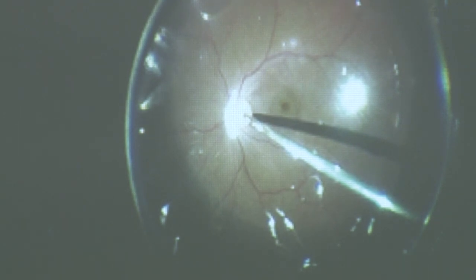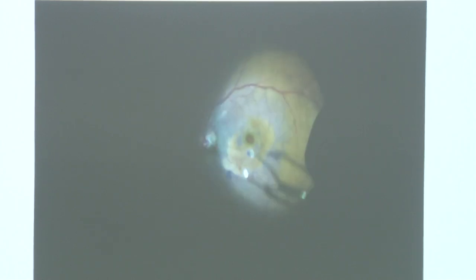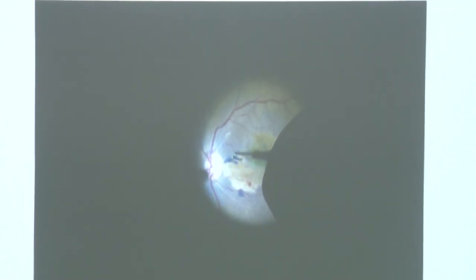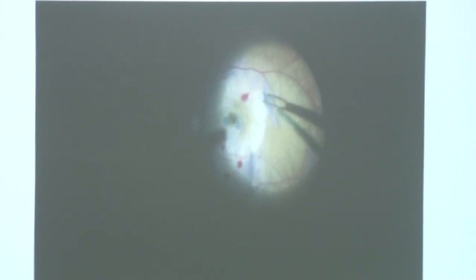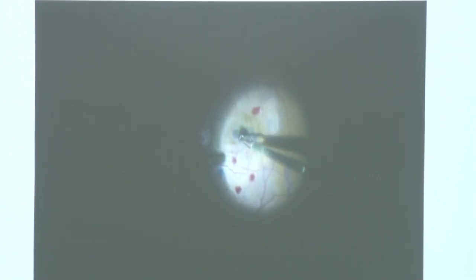This was a failed macular hole surgery from another center, and the patient came for a second surgery. Since vitrectomy was complete from the earlier setup, we just stained the ILM and found that a lot of ILM tissue was left — that was the probable cause of non-closure of the hole. This actually helped us, because if ILM is completely removed and the hole doesn't close, it becomes more challenging, requiring a free flap, retinal autograft, amniotic membrane graft, or capsular graft. In this case, we carefully removed all the remaining ILM, took a free flap and placed it over the hole, then covered the free flap with the adjoining ILM present around the macular hole edges, which gave an excellent outcome.